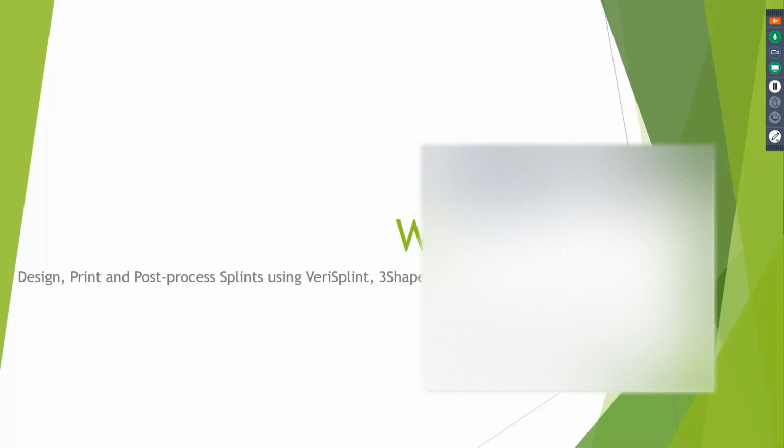Gina asks, can I cure it with the same UV light I have for my VeriModel OS, or is that extended UV exposure what you meant makes it cloudy? So what UV light are you using for your VeriModel OS? If you're using the little Asiga flash unit, that will not be sufficient for your splints. Not only will it not cure the material to the proper recommendations, but it's also not going to be a 510K cleared appliance.